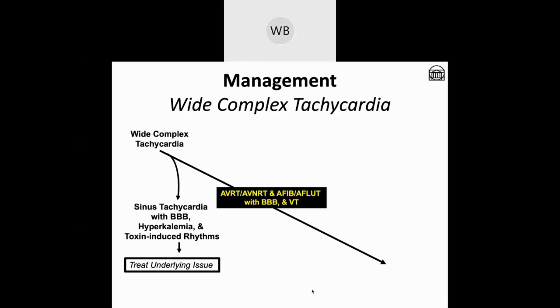So the next identification and decision point is identifying the entity that is now referred to as complex atrial fibrillation or atrial flutter. Now, I'm going to include atrial flutter in this talk on this particular subtopic, but from now on, I'm just going to refer to it as complex A-fib. So that includes A-fib and A-flutter. So what is complex A-fib? Complex A-fib is A-fib with RVR, so rapid ventricular response, so rapid A-fib, and another significant physiologically stressful event occurring.